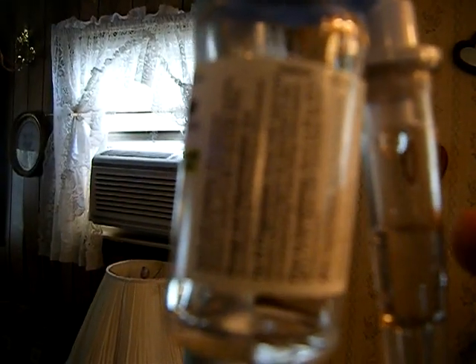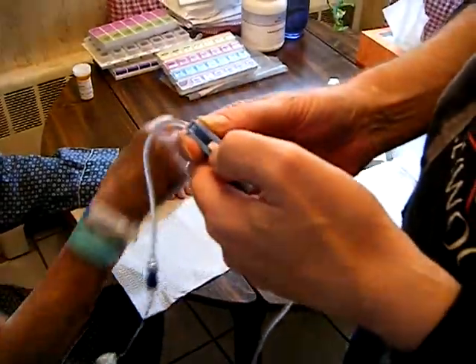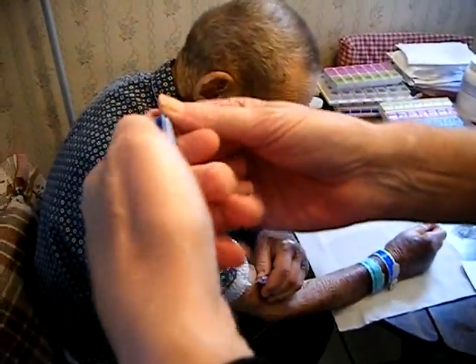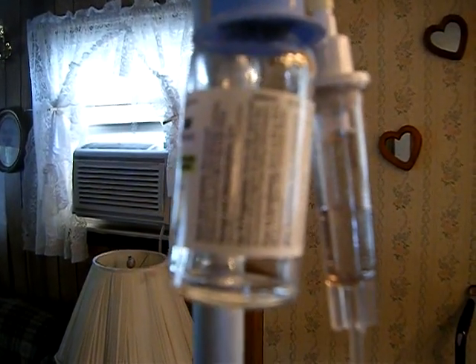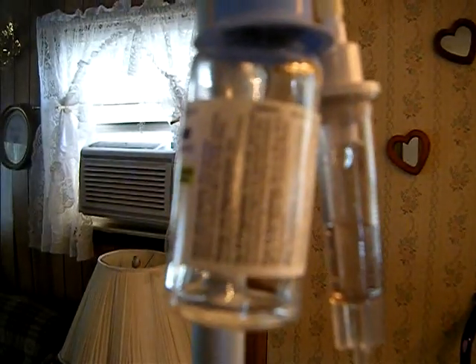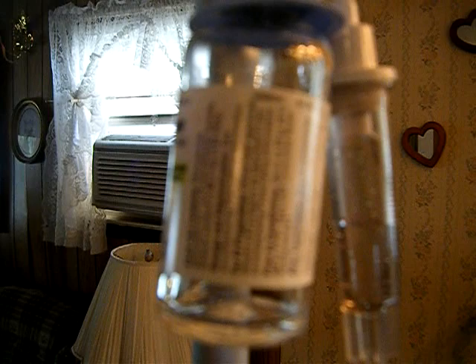We're going a tiny bit too slow, but we want to maintain the level of the medicine about halfway. So I'm going to open up just a tiny bit using the little roller. Now it's sped up a lot — if it's fully open, that's way too fast. So I'm using the same little white roller, using my thumb to slow it down. It's still going too fast, so it's very precise. One hippopotamus, two hippopotamus. I think we have it just about perfect. That's pretty good for the first try.